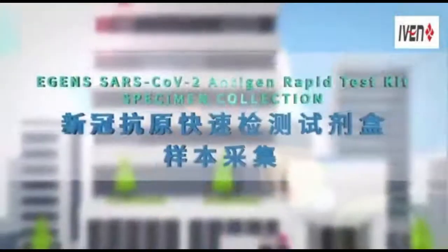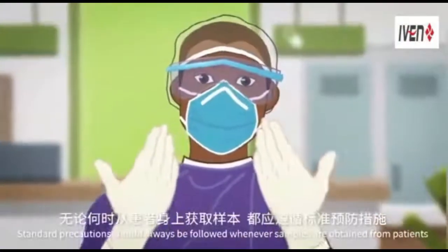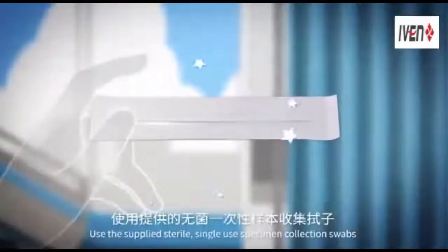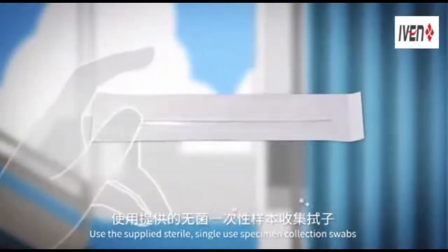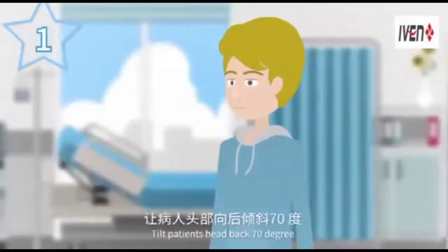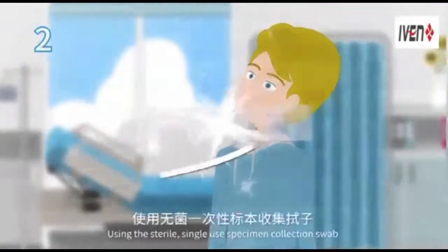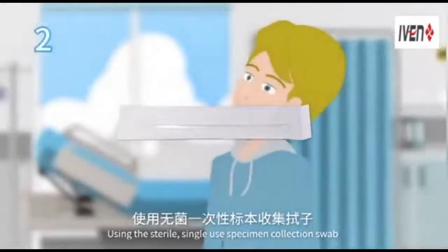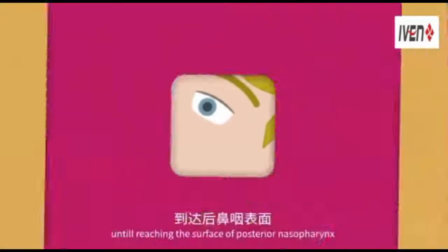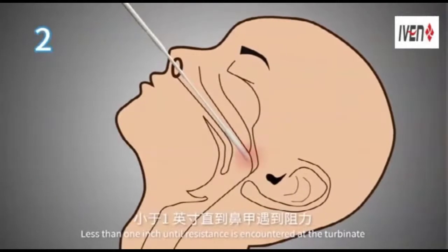Specimen collection. Standard precautions should always be followed whenever samples are obtained from patients. Use the supplied sterile single-use specimen collection swabs. Nasopharyngeal specimen collection. Step 1. Tilt patient's head back 70 degrees. Step 2. Using the sterile single-use specimen collection swab, carefully insert it through one nostril of the patient until you reach the surface of the posterior nasopharynx, less than 1 inch, until resistance is encountered at the turbinate.